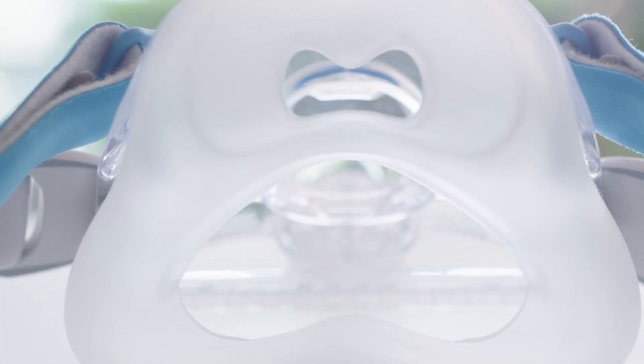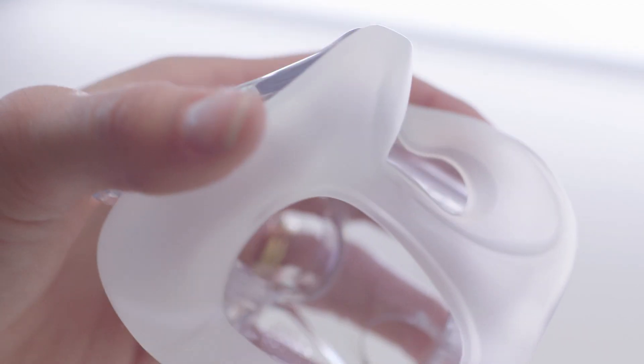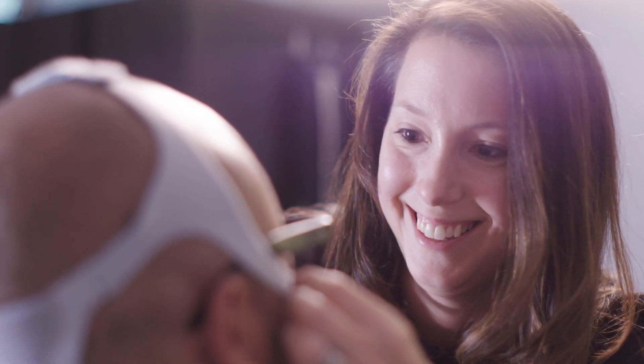The Evora Full mask features a soft silicone seal that works in combination with our frame and our stability wings. It's super soft and super comfortable, but when they move around at night, those stability wings keep the geometry of the seal and stop it from becoming unstable.